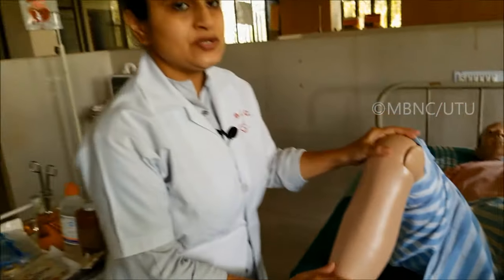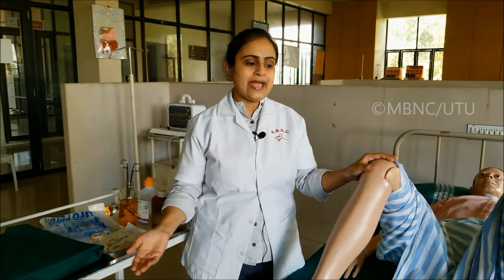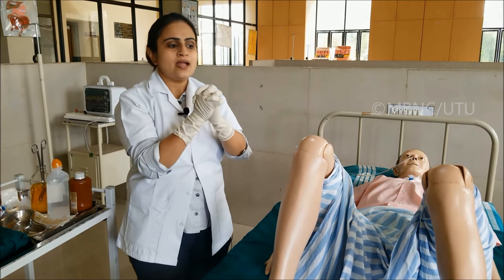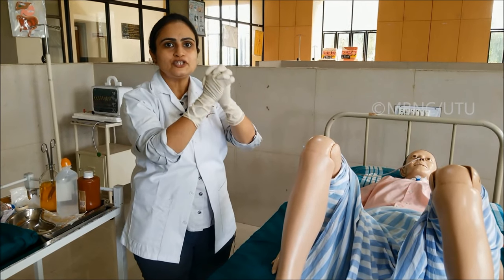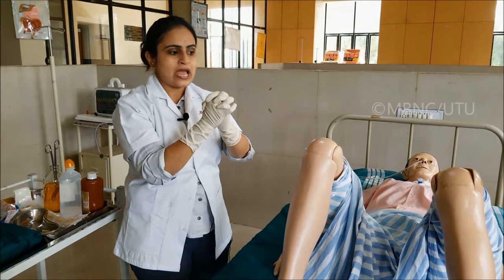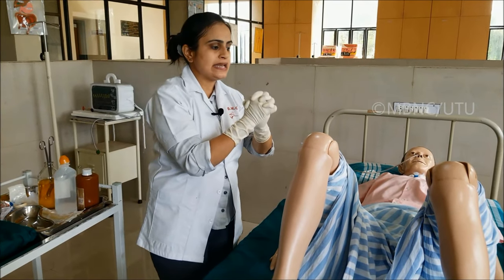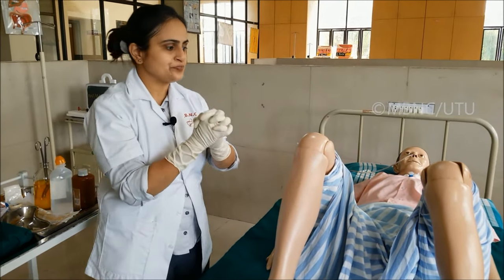After draping the patient, go for hand washing. After hand washing, wear two pairs of gloves.